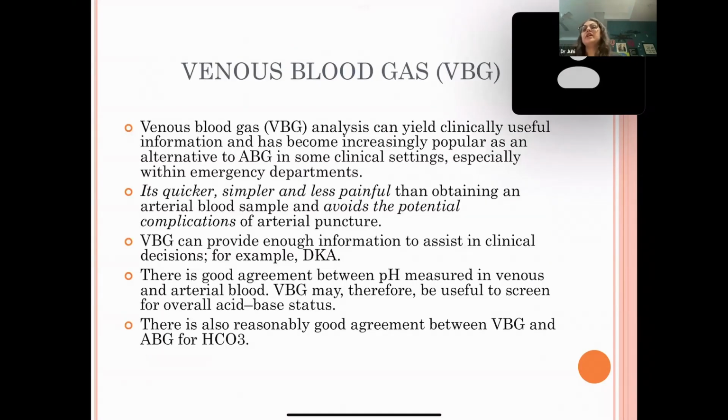Okay. Just a slide on the differentiation. So nowadays, the popularity of the venous blood gases is also increasing, especially in the emergency department, because even VBG can yield almost similar information.